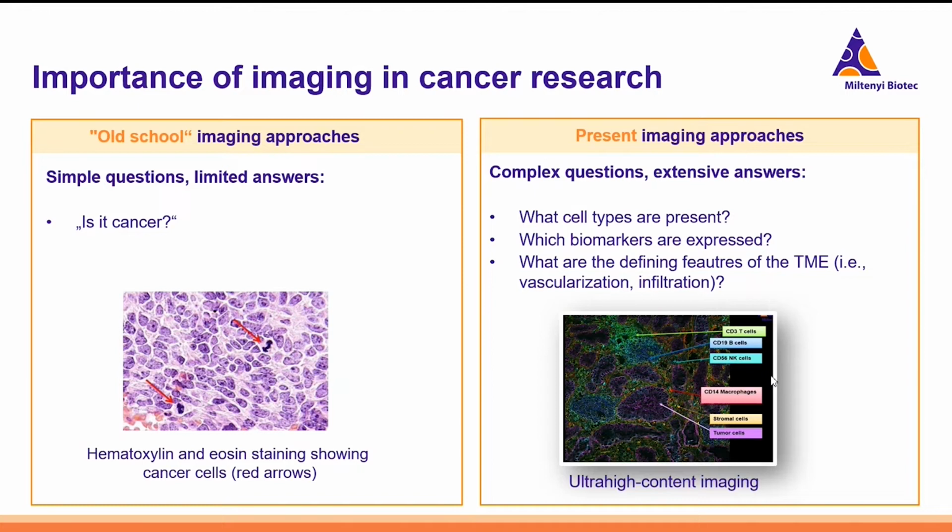So it is also important to understand this crosstalk between the immune cells, to each other, and between the immune cells and the tumor cell. And many other questions you can answer. So ultra high content imaging has great benefits for cancer and TME research.